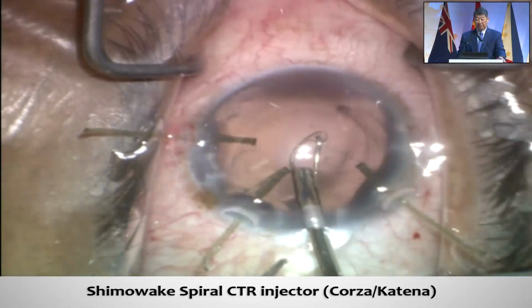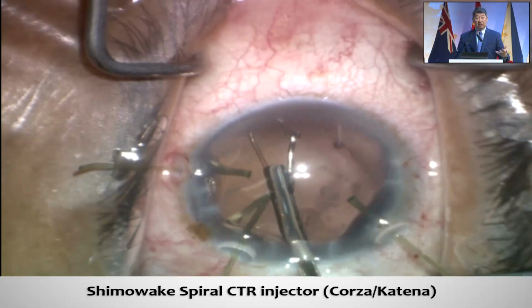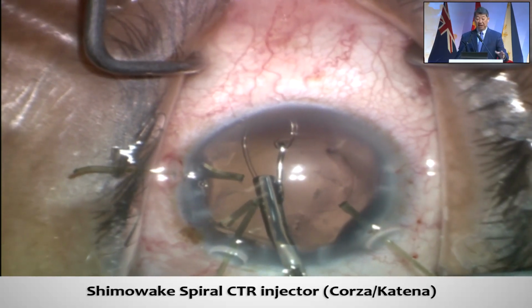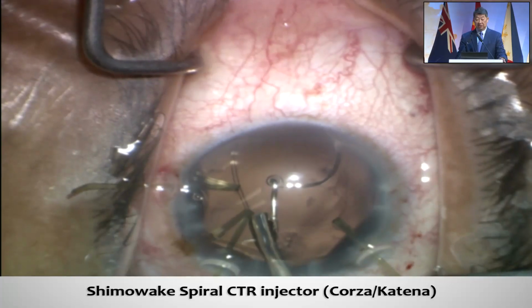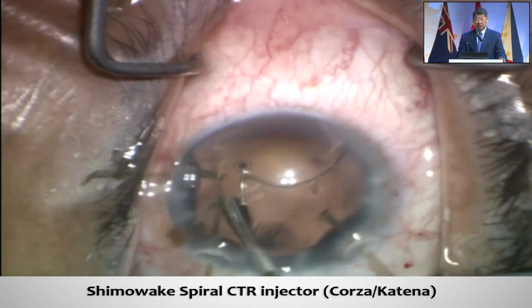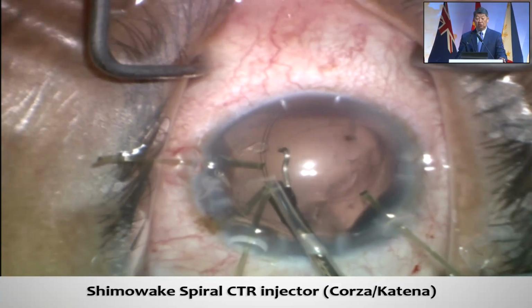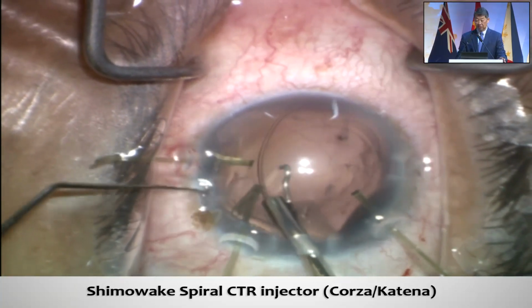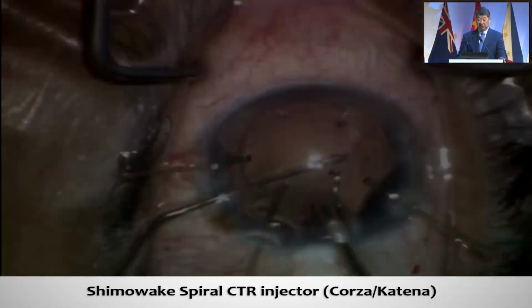When you have capsule retractors, this can be hard because the eyelet can get tangled in the retractors. The bag may be lax in those areas. So you can see here how this nicely allows this to unfold and basically avoids further trauma to the zonules from the actual insertion. Sometimes it doesn't fall off. I'll use a second instrument to knock that off.